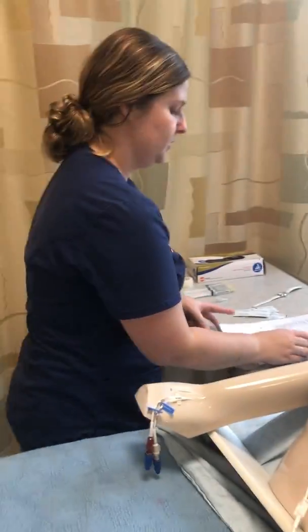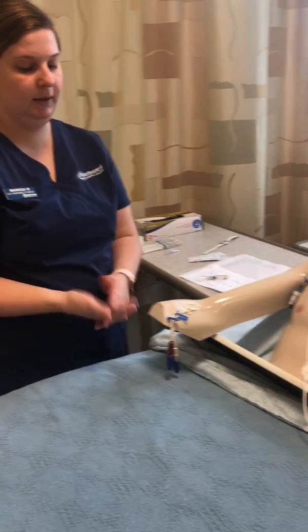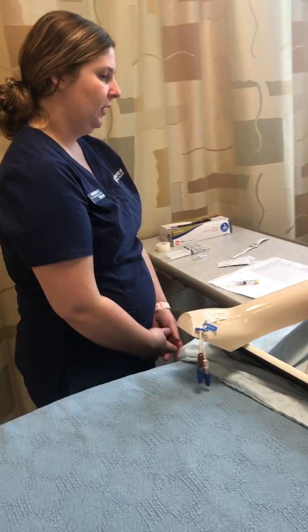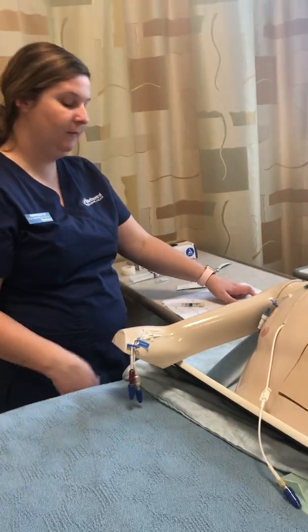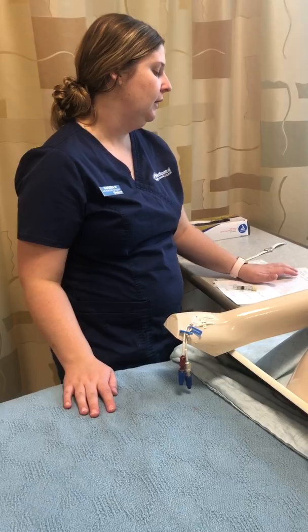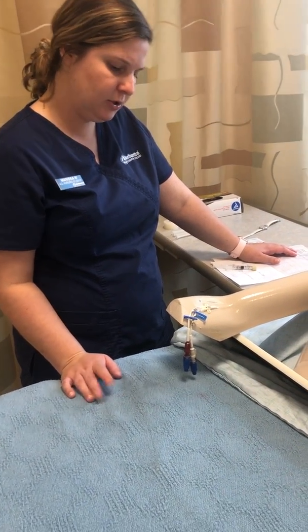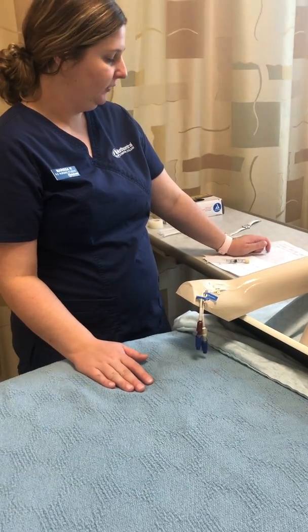So once you come in the room, hi Ron, my name is Marissa and I'm a student nurse, and I'm going to be giving you some medication through your PICC line here. Before we get started with anything, can you tell me your name and date of birth? And he says his name is Ron Smith and his date of birth is 2/19/1955. I'll check the wristband and it says Ron Smith, 2/19/1955. And I'll say, okay, Ron, I have that you have some allergies to morphine. Is there any other allergies that we don't know about? And he says, no, just the allergies to morphine.